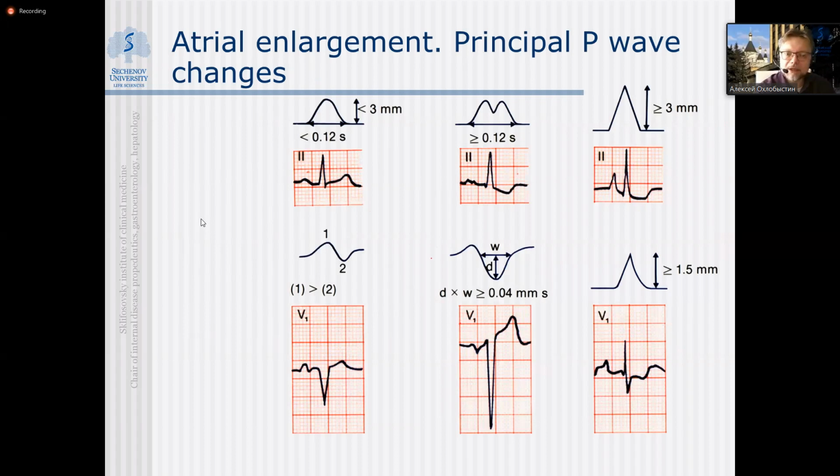What will happen in the case of atrial hypertrophies? Very roughly and maybe in a primitive way, let's discuss what will happen to the P wave in the case of hypertrophies. Let's start with left atrial hypertrophy. There will be some kind of extra tissue in the left atrium, that is away from the normal cardiac pacemaker, the origin of activation of the atria, which is in the right.